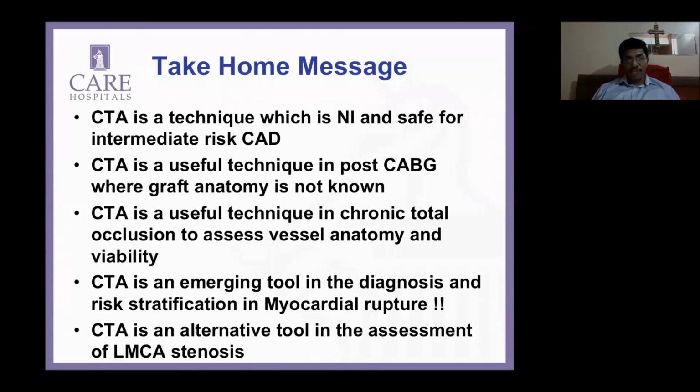So while we initially looked at calcified, partially calcified, and non-calcified, now we're looking at the four dangerous things, which is basically somebody with lipid-rich plaque, somebody who has positive remodeling, somebody who has spotty calcification, and the fourth being somebody who has a very eccentric kind of plaque, a napkin ring kind of plaque. So these four, I call them the dangerous quartet.